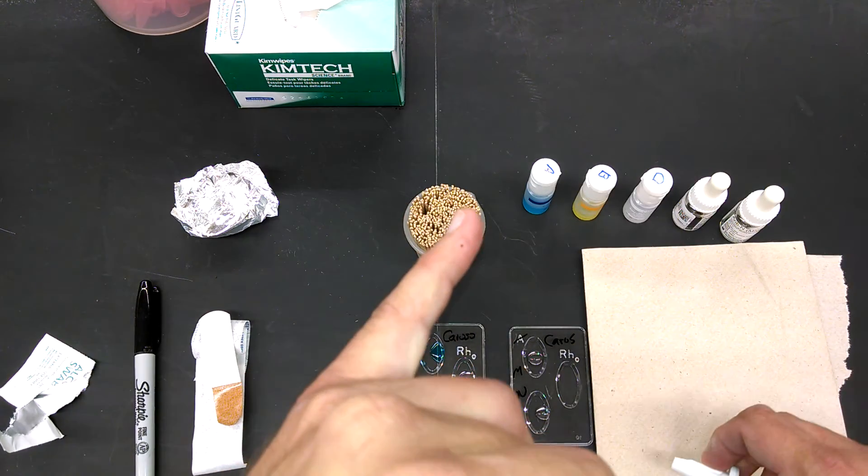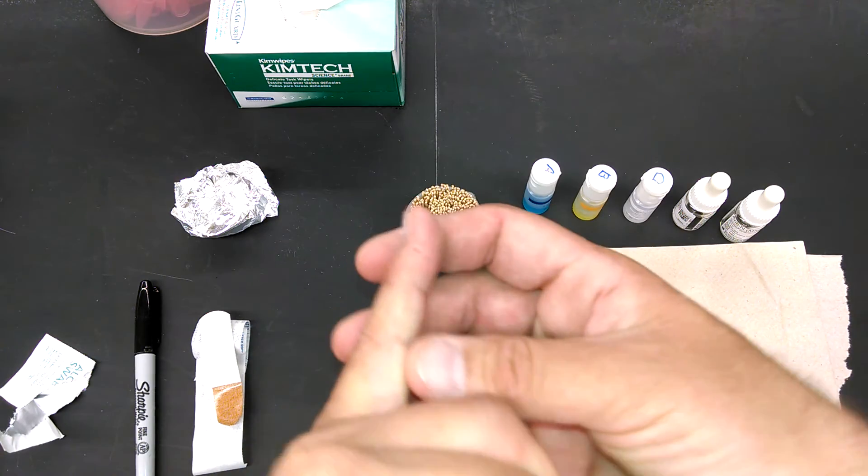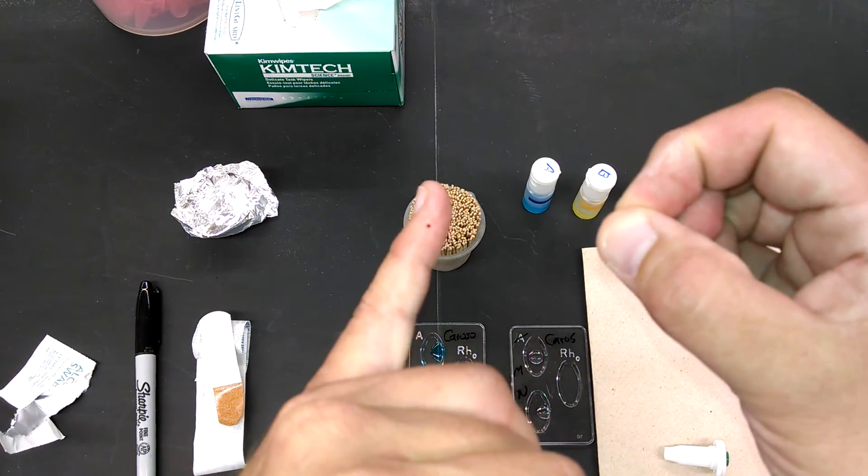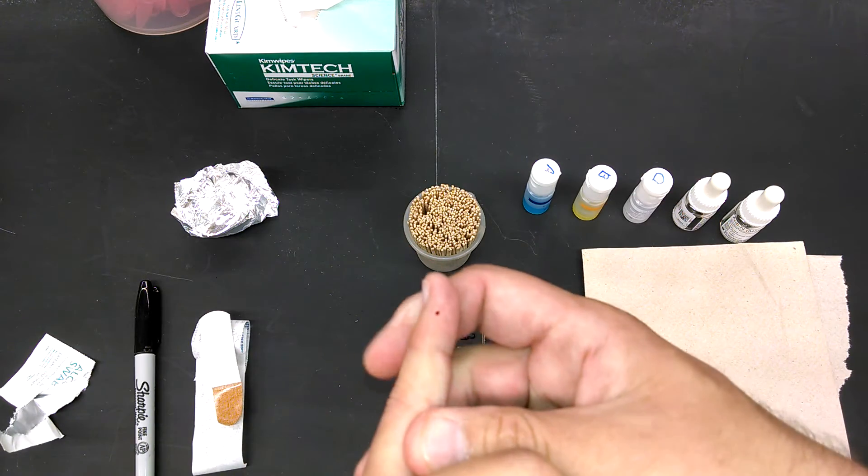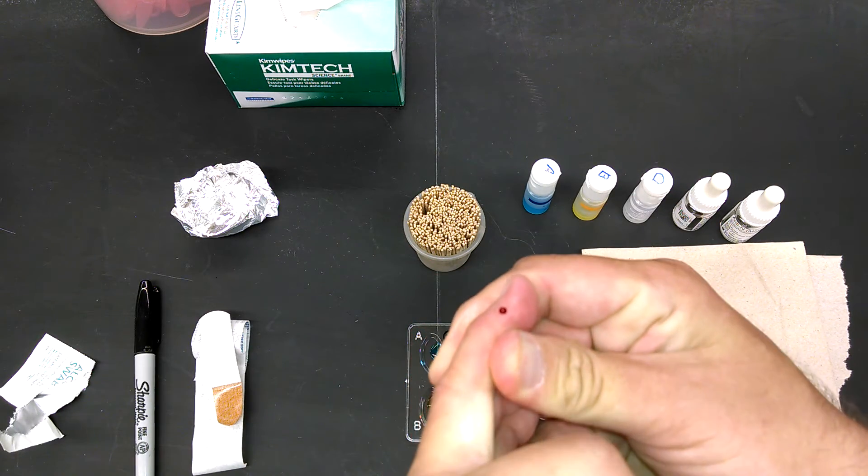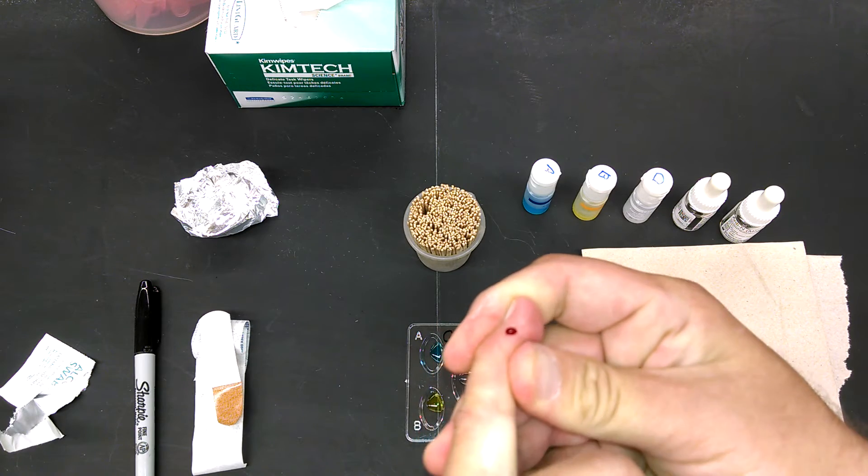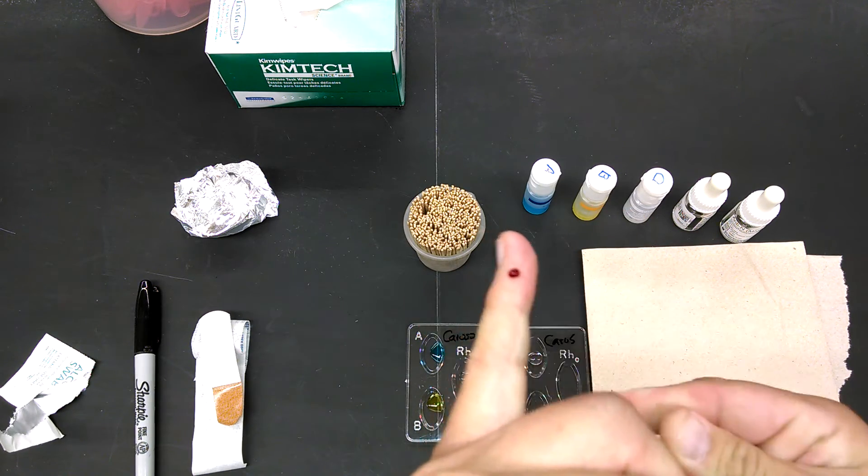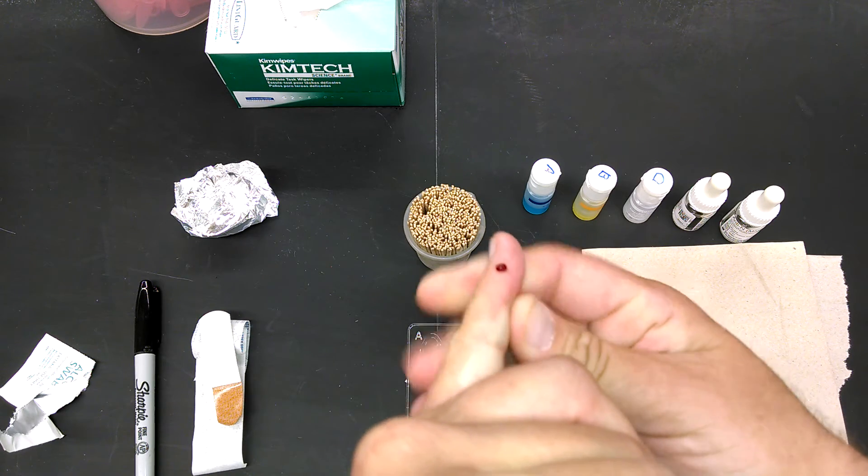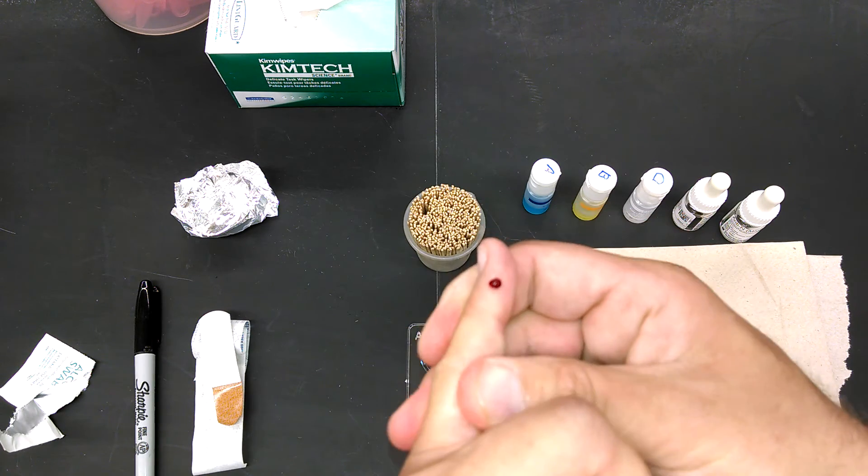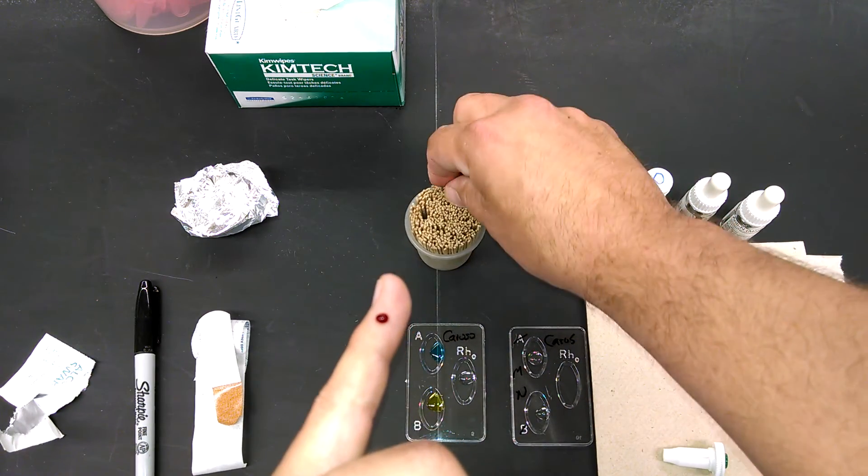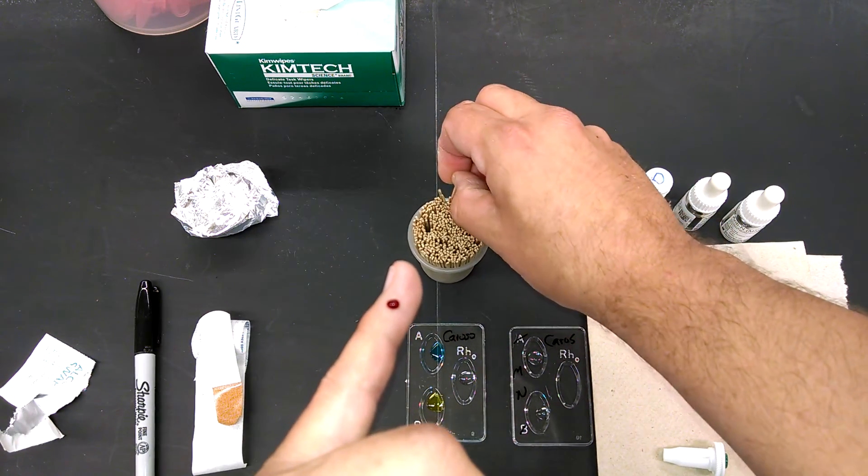That's it. Not a big deal. It isn't going to start gushing blood. It's a very tiny little needle. So what you're going to have to do is you're going to have to kind of squeeze to get some blood. This is very small. You won't even feel it. Once you get the blood, like I said, the trouble you're going to have is getting blood, not bleeding.